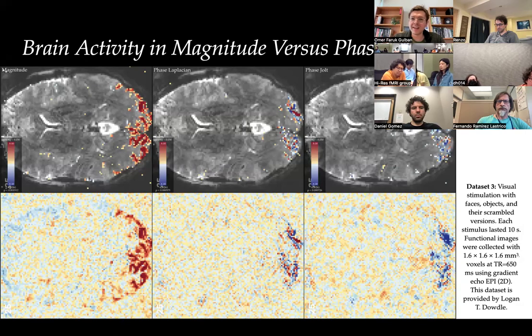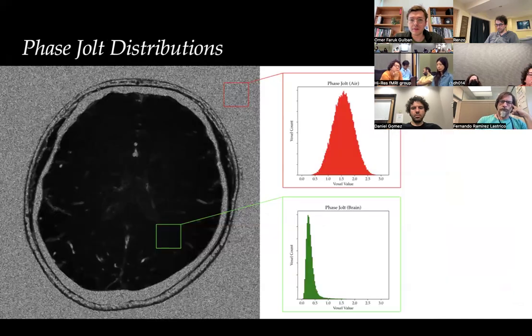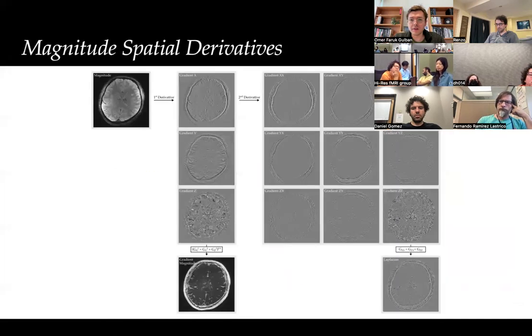Yeah, I asked this question because in the beginning of your talk, you were showing some anatomical images that work like edge detection. It just emphasizes the edges more. So if any derivative could do that in the time series, if it works like that, I'm not sure about that.